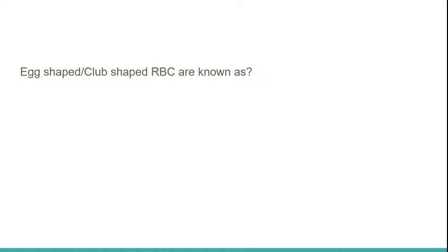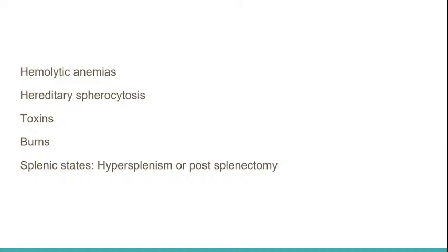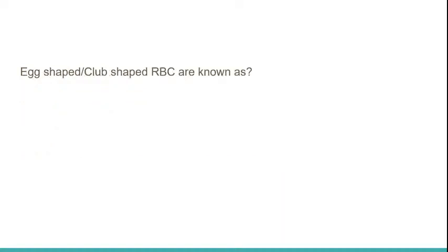Okay, now we'll look at the next slide. In the next slide, we're going to talk about egg-shaped or club-shaped RBCs.